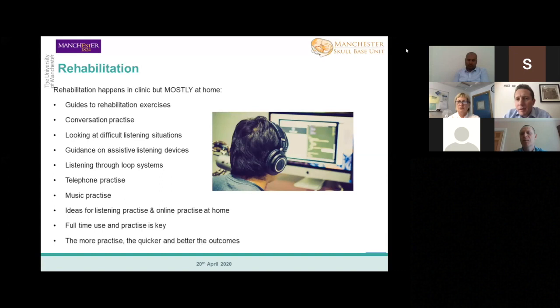I mean, there are some issues. The question was about paediatric patients, and obviously that brings into issue congenital deafness and processing and things. So if you were going to implant a congenitally deaf ear with normal hearing in the other side, it would really need to be done very young. Yeah. And also scan carefully, because unilateral absent nerves are actually quite a common cause for unilateral congenital deafness. Yeah. Okay, fantastic.